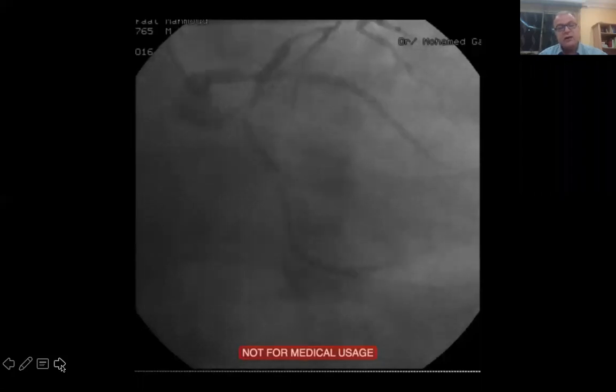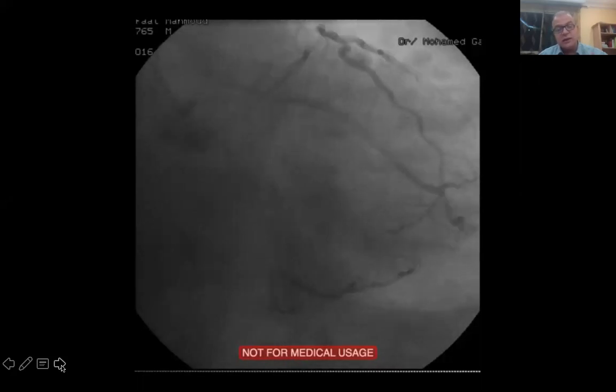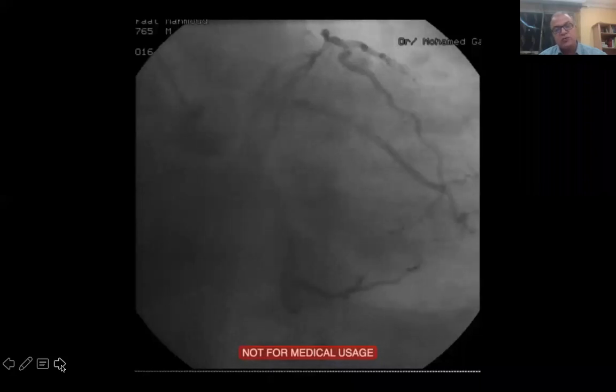Number 3, I think we should end any trifurcation lesion either with triple balloon inflation or with sequential double balloon inflation, kissing balloon inflation. And number 1, LAD to ramus, number 2, from ramus to circumflex. This is just my comment.